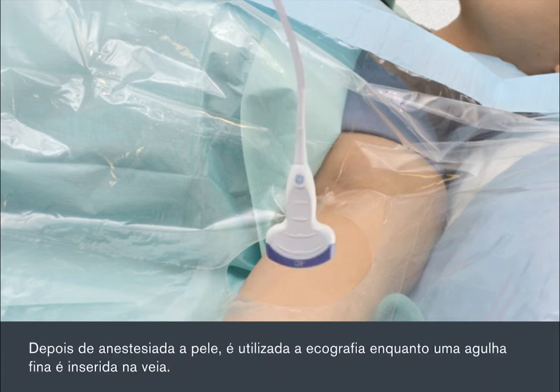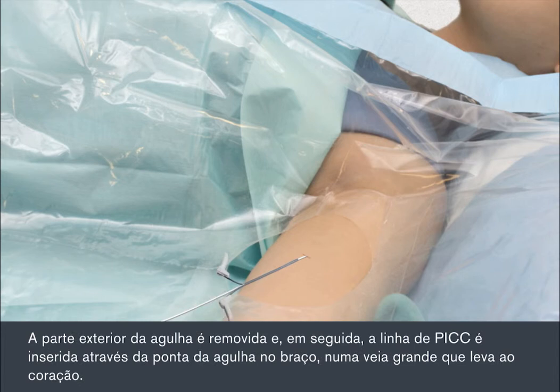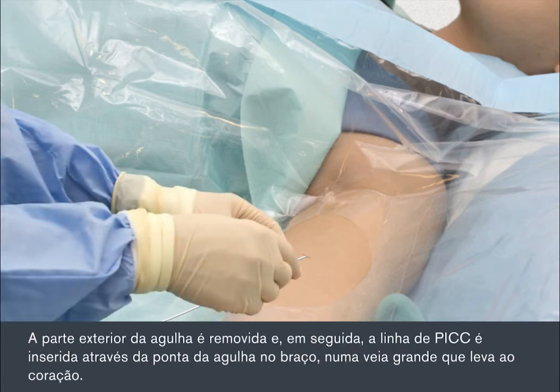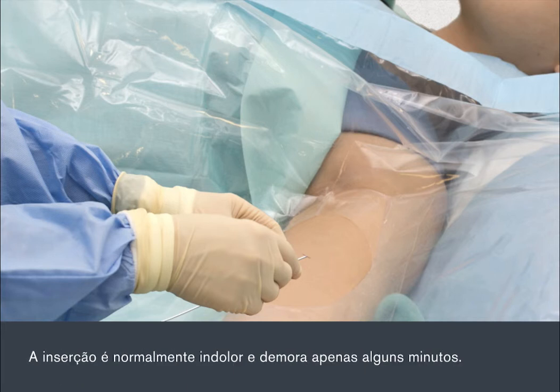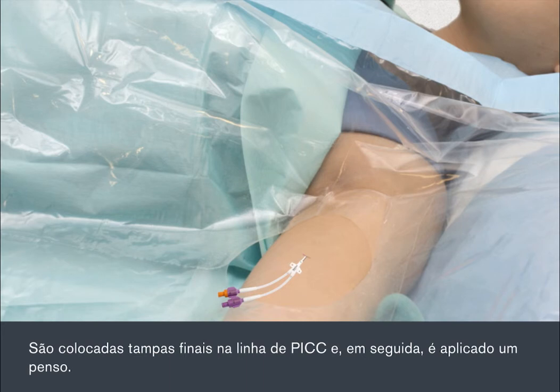Once the skin is numb, the ultrasound is used while a fine needle is inserted into the vein. The outer part of the needle is removed, then the PIC line is threaded through the tip of the needle in your arm into a large vein that leads to your heart. The insertion is usually painless and takes only a few minutes. End caps will be attached to the PIC line, then a dressing is applied.